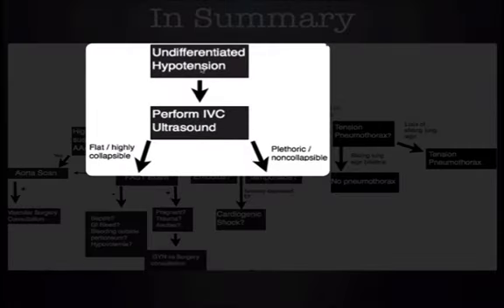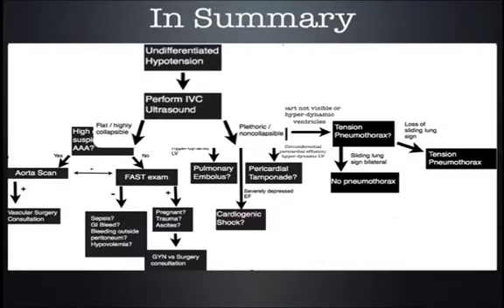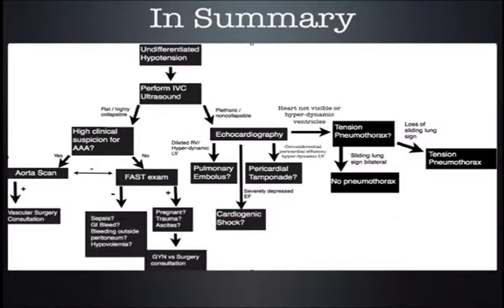We have an undifferentiated hypotensive patient. I recommend you start off with IVC ultrasound, and you're going to determine whether that IVC is flat and highly collapsible or it's plethoric and non-collapsible. And once you've determined that, let's assume that it is flat and highly collapsible.